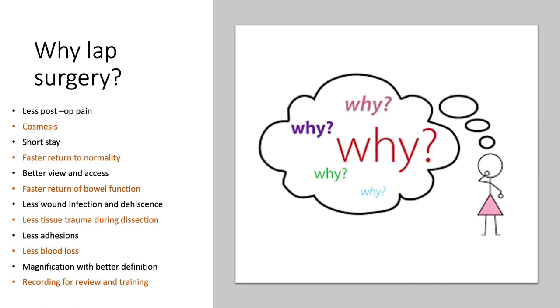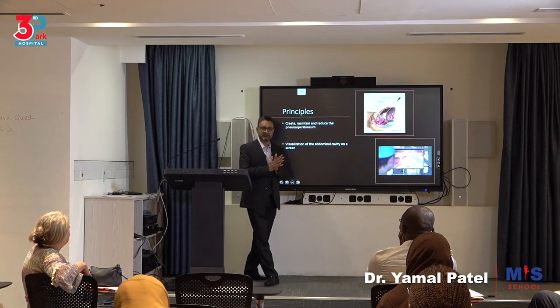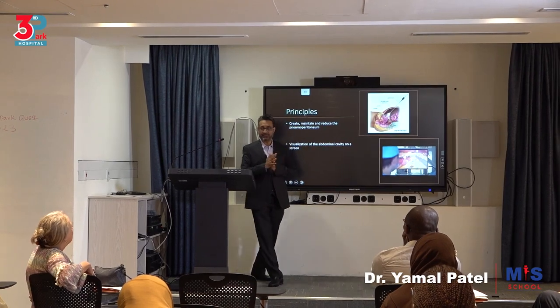blood loss, although you will see it magnified, but it will be less if you follow the principles, magnification with better definition, and remember, these are surgeries that can be recorded for review to see how you're doing or how the surgery was done and for training purposes. A few principles I believe that are very important to mention.